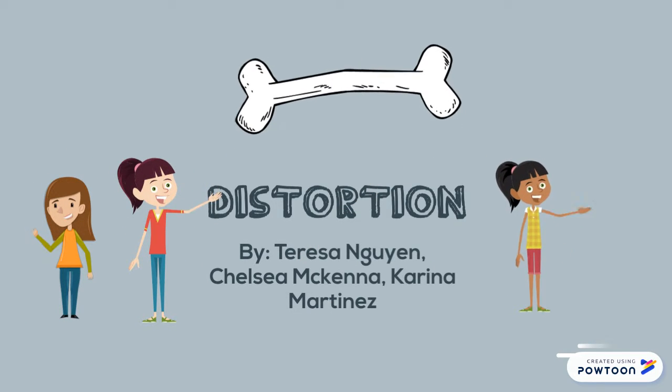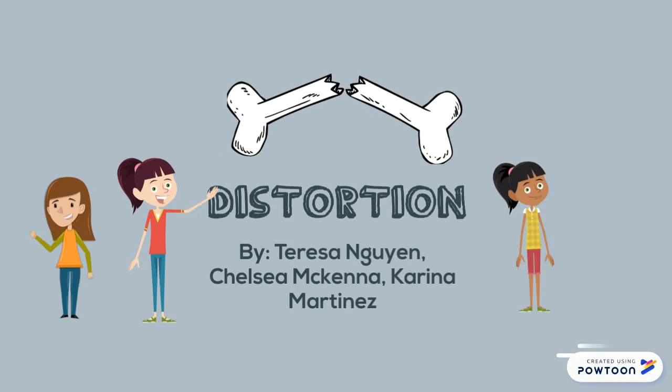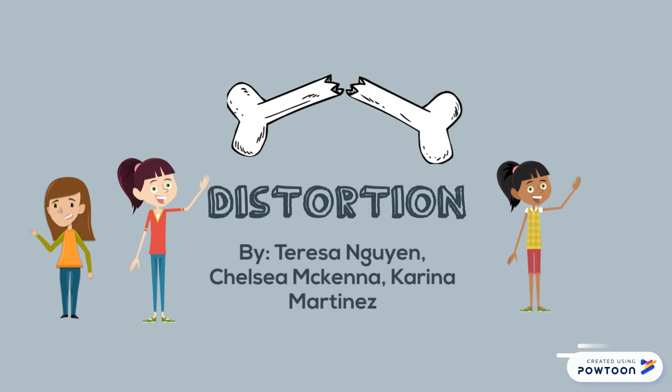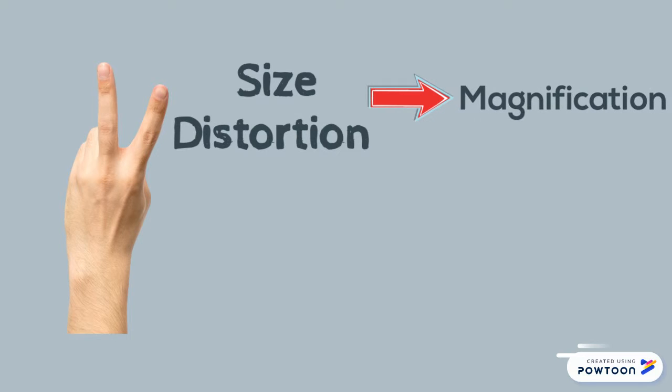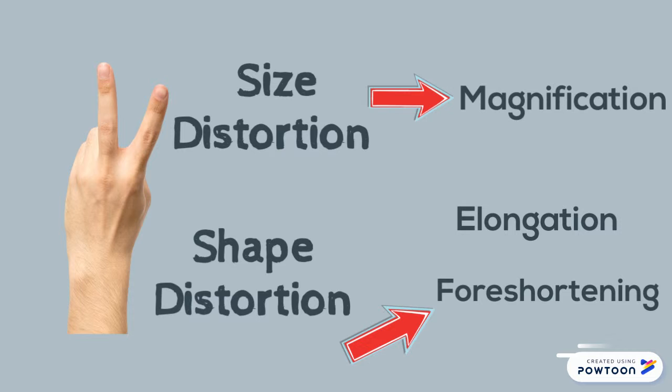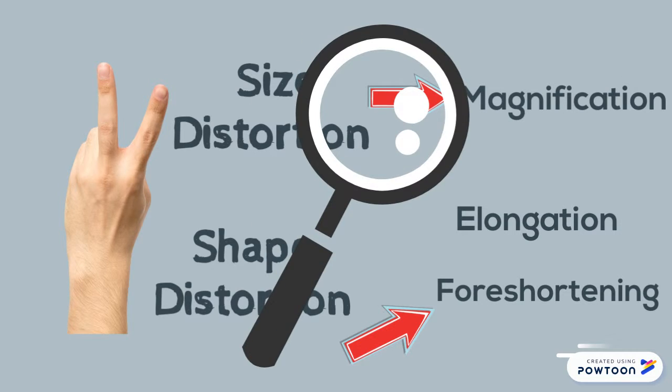Let's begin with the definition of distortion. Distortion is one of the geometric properties affecting radiographic image quality. It gives a misleading presentation of the size and/or shape of the imaged anatomical part. There are two types of distortion: size distortion, which describes magnification, and shape distortion, which describes elongation and foreshortening. Let's take a closer look.